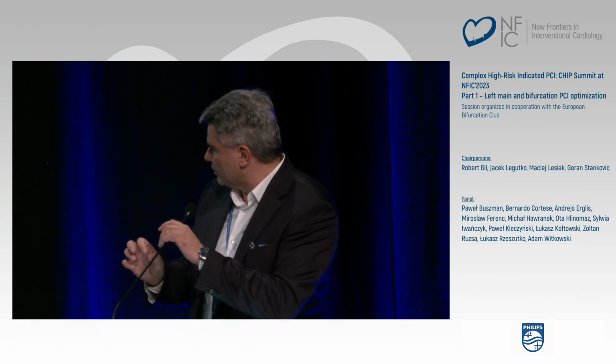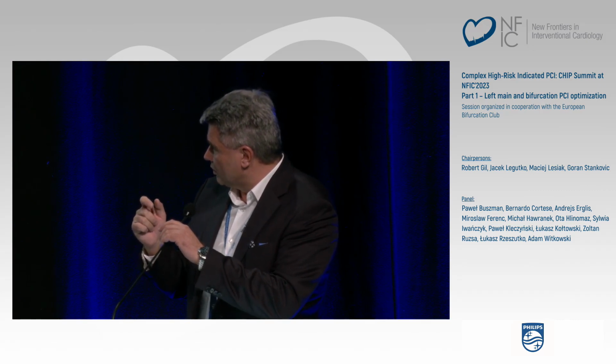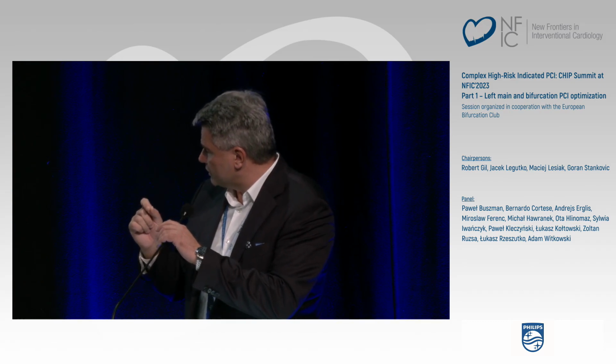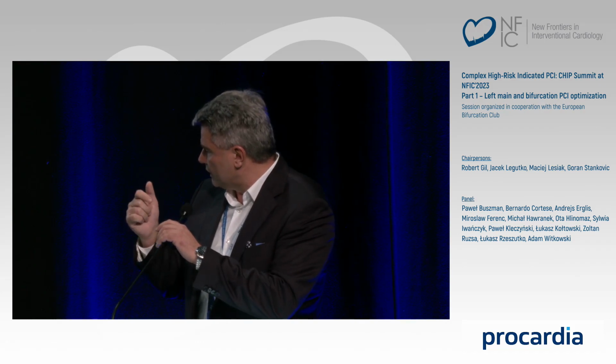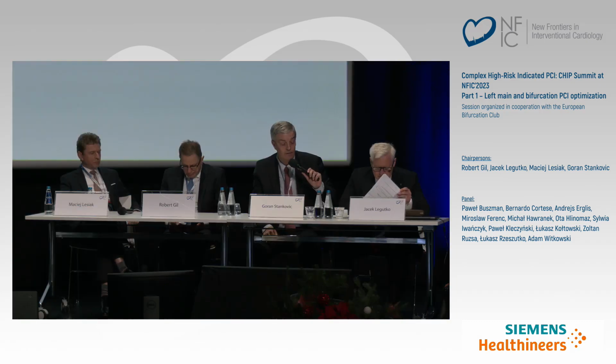The second question is on your consensus, when you say that you want to automatically upsize the angio QCA. I think that it could be dangerous in the mid LAD, when you have a 2.5 to 3 millimeter diameter and you go 10% more. It could be a risk of perforation for many arteries in the mid LAD after the first septal branch and first big diagonal. Yeah, thank you, Dariusz.